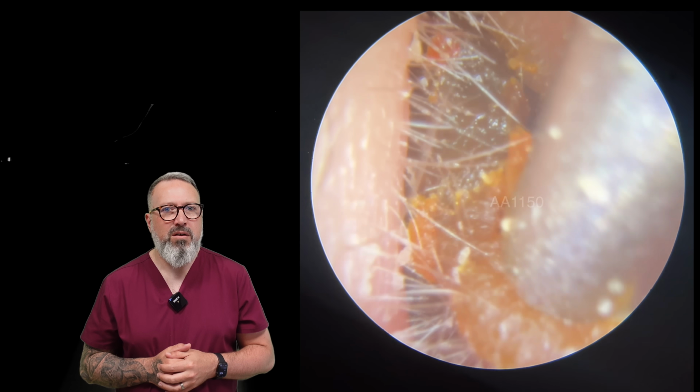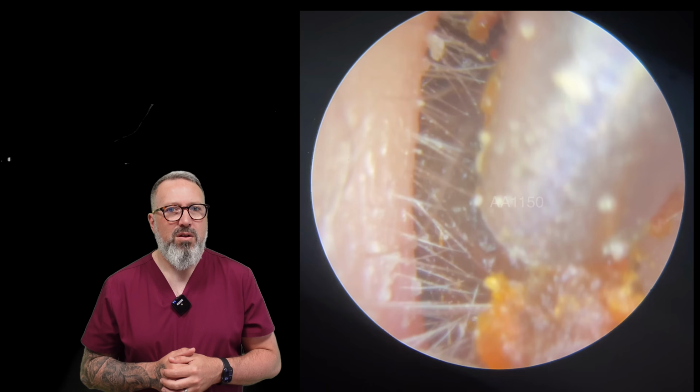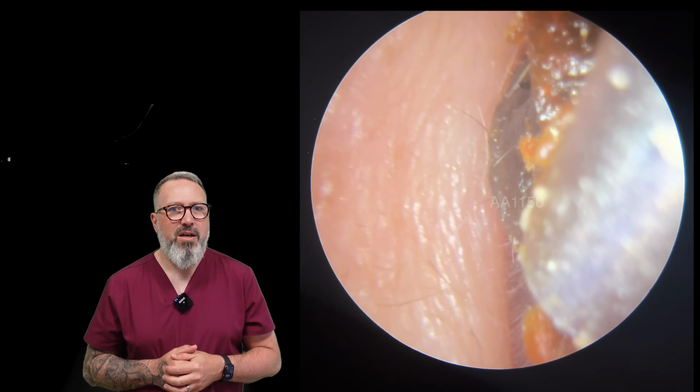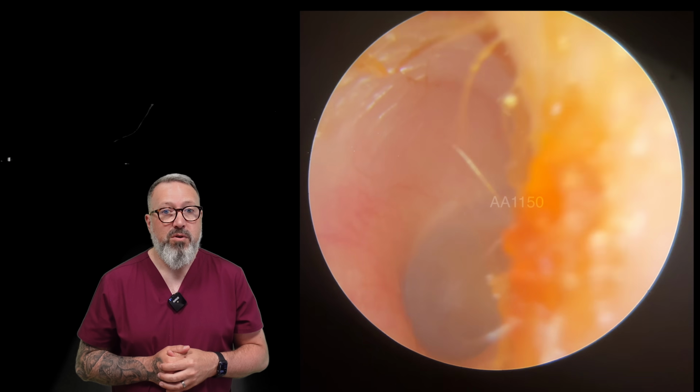A little bit more of a wiggle. Not quite there. Let's give this a little bit more. There we are. And out that comes. Nice one to do, that one. Nice hard piece of wax, that one. Always lovely ones to do.